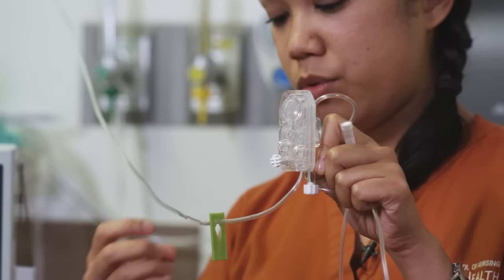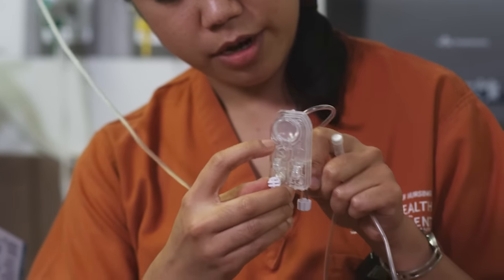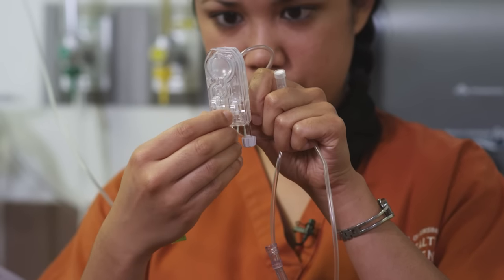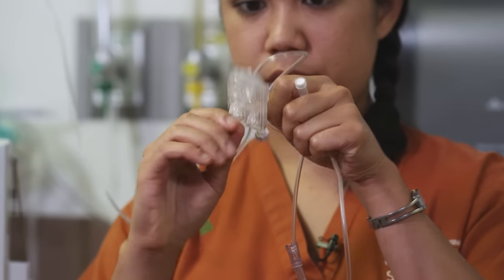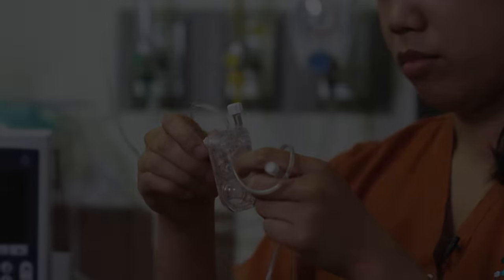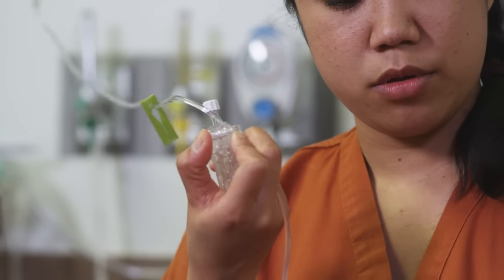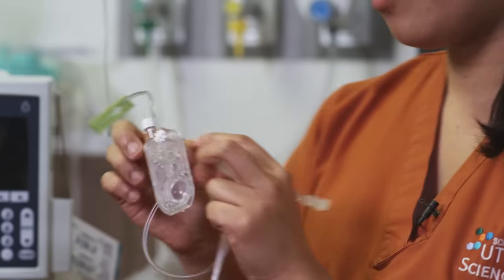Watch your fluid. You're waiting for the dome to be filled with fluid right there. Once you see fluid on your dome, we're going to flip the cassette. Once your tubing is all the way primed, you just push into this white screw to stop the flow. Now we're ready to insert the cassette into the machine.